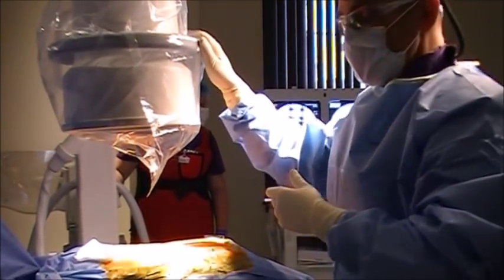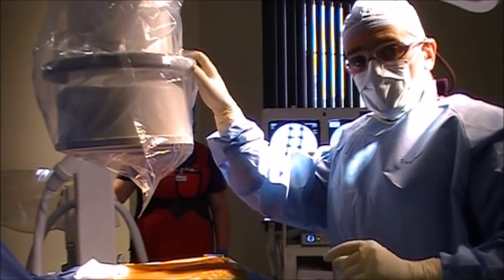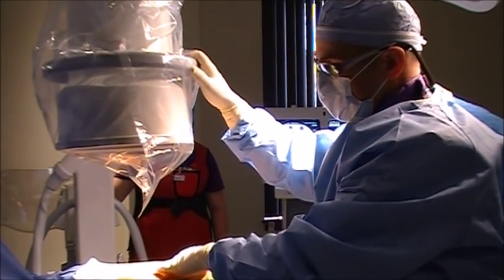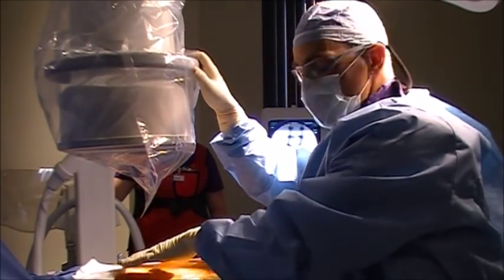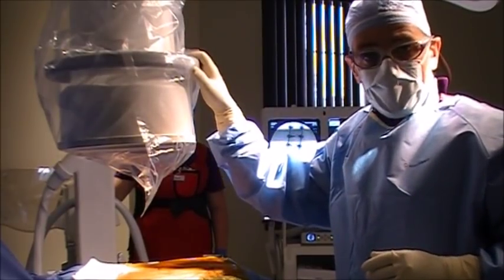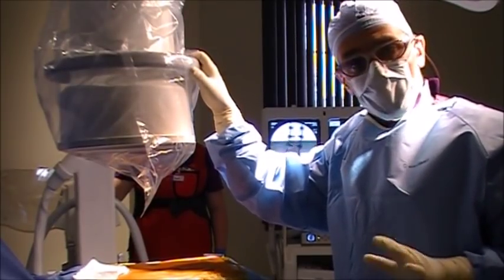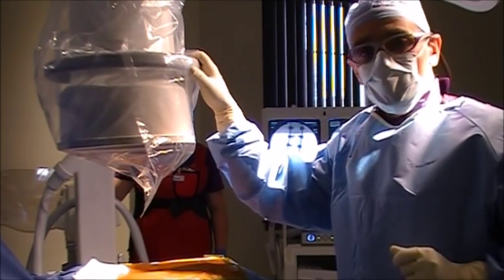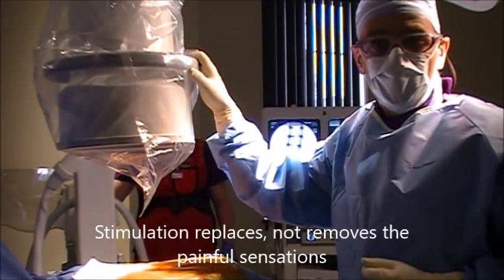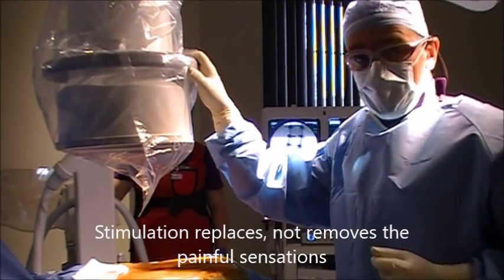We're going to try to enter the epidural space in the upper lumbar spine, and once the needle is in we'll advance a small wire through it to rest on the back of her spinal cord at about the T8 or T9 area. The idea is that if we can deliver electrical stimulation to the back of her spinal cord, we can replace the sensation of her intractable back pain and sciatica with a more pleasurable sensation — a buzzing or vibration — that she'll prefer.